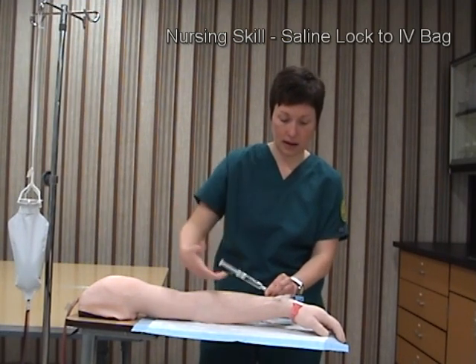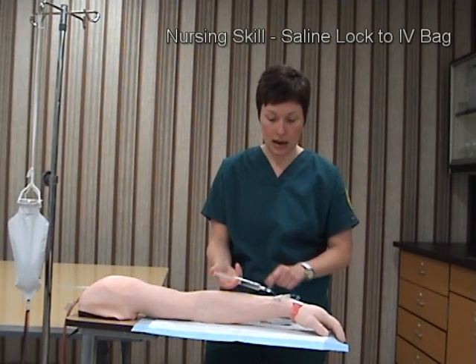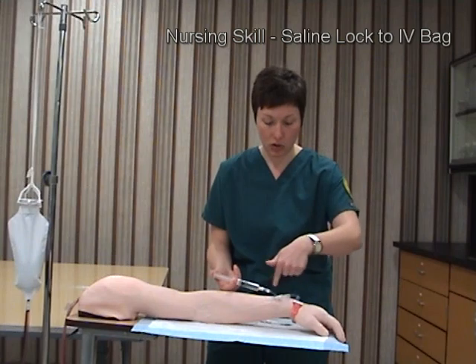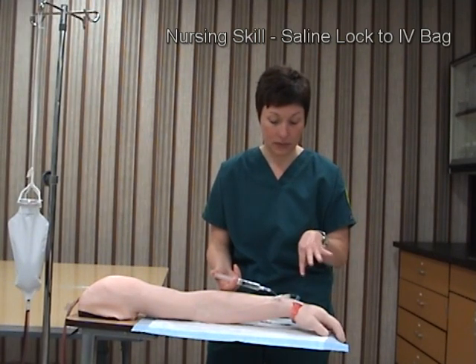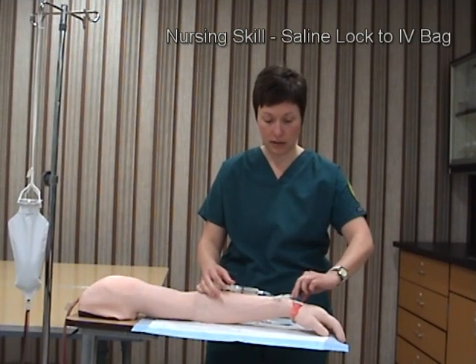I'll separately connect the saline flush and slowly administer about three cc's. I'm looking for signs of infiltration, redness, and any difficulty with the administration of those three cc's.